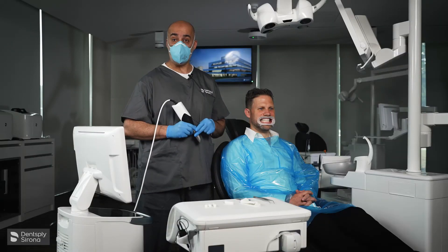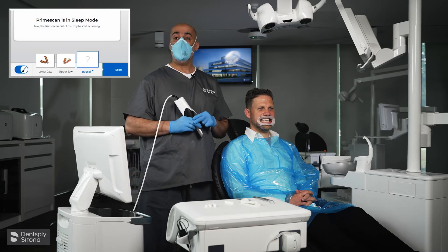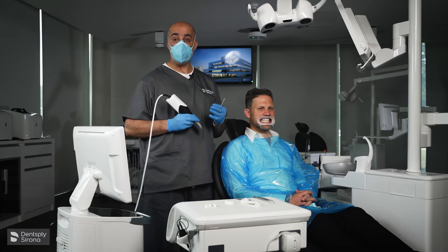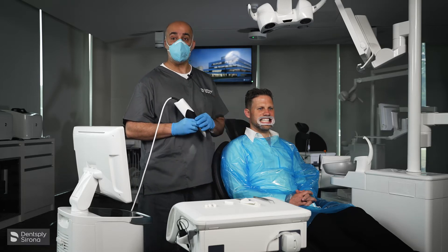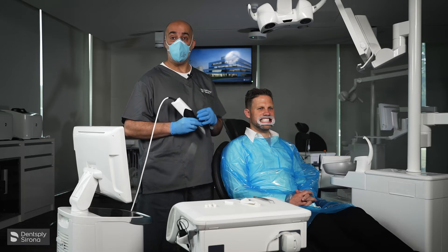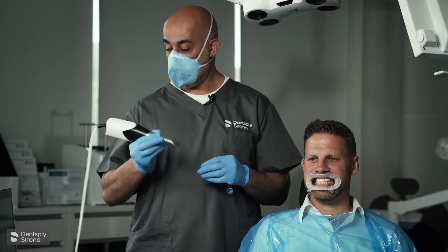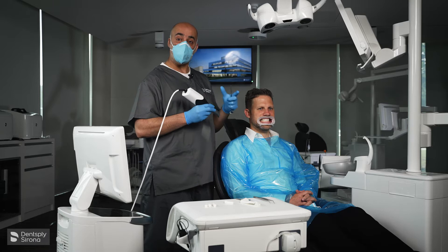Now we need to record the occlusion — that is your buccal scan — so you're going to select the buccal tab. The patient is upright, so it's a centric occlusion position or ICP, which is a functional position for the patient. I always record it upright. If you're doing a splint that they'll wear at night, I will record the occlusion or buccal bite with the patient lying supine. We're going to put both the upper and lower models together — that's what your buccal bite is doing: stitching the upper and lower models together.